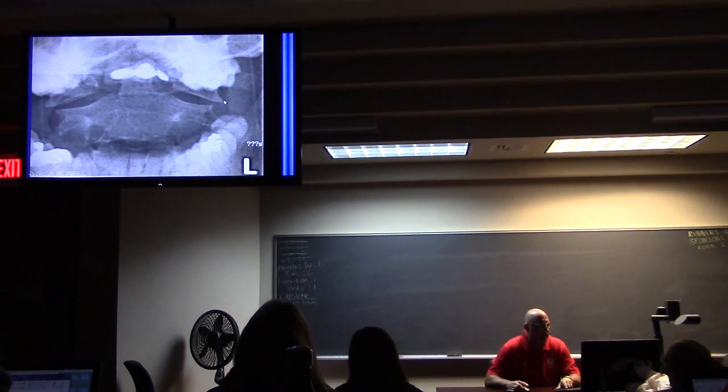Same thing here. See how the lateral masses hang over? So there's a fracture there somewhere. I think it's probably right here. You don't really have to find the fracture, you just have to find that it's abnormal and possible. That's all I've got to do.